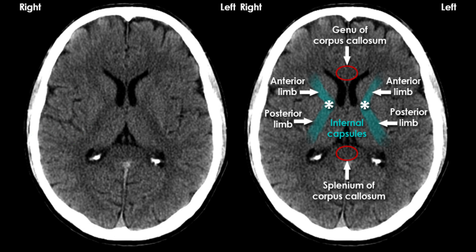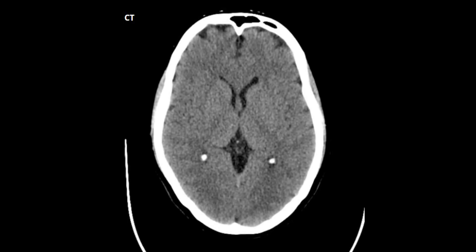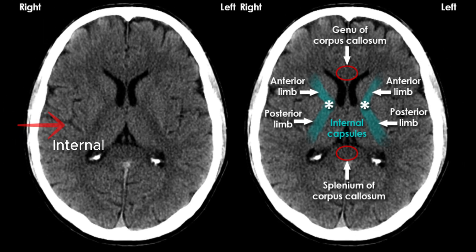This L-shaped structure here lying next to the lateral ventricles is the internal capsule. It comprises of anterior limb, genu, and the posterior limb. At this deep level of the brain, around the ventricles there are bundles of grey matter that form the Deep Brain Nuclei, and these nuclei lie adjacent to the internal capsule.